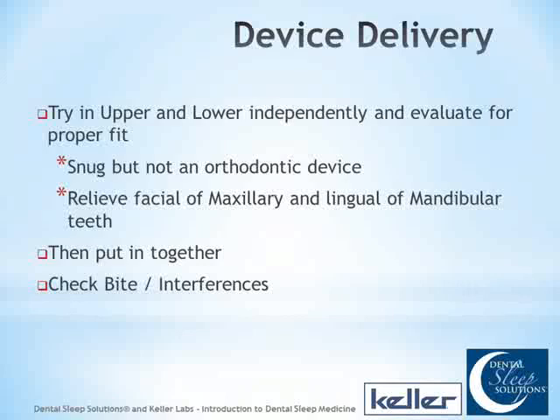And yeah, I agree, Rich, on everything you said. I want to add a couple of things. I'm a little bit lazier than you, and I like to put it on Keller on occasion. If I notice those teeth being lingual or facial, you can just tell them to block out around those a little bit when they construct the device, and that way it's already done at the delivery, because I totally agree. Any tooth that's out a lot further on the facial on the upper or on the lingual on the lower, they'll end up getting discomfort out of that tooth.